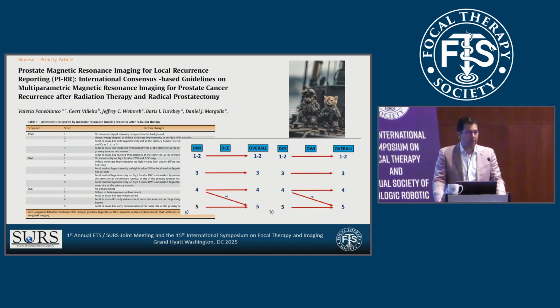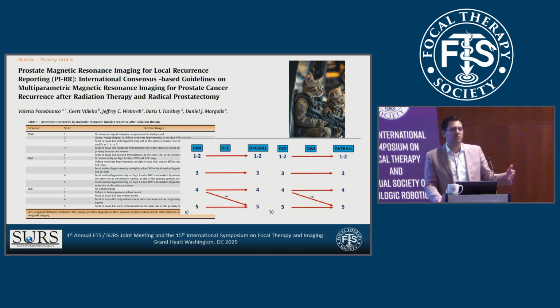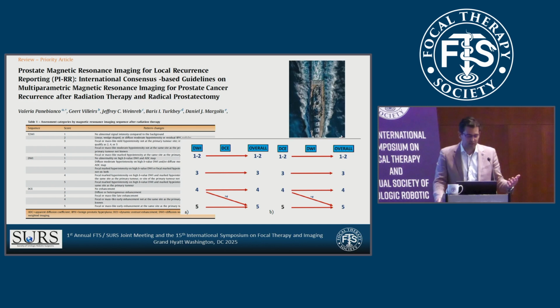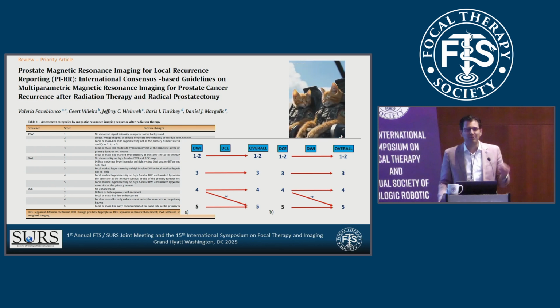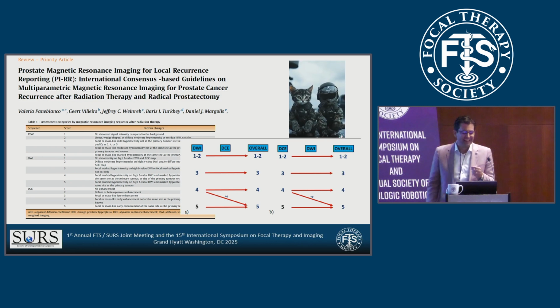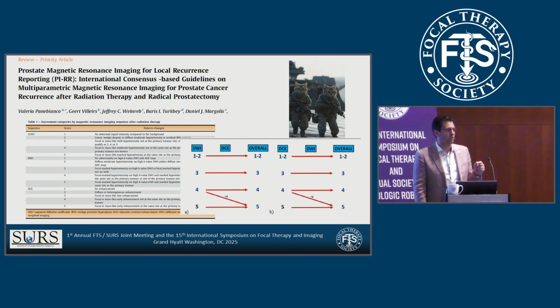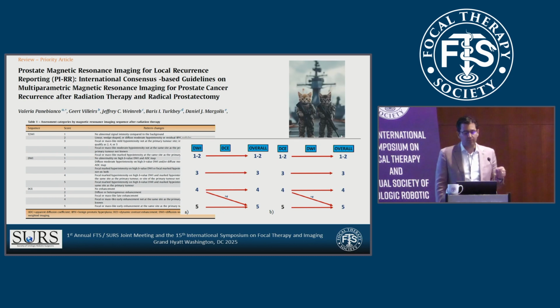This is my favorite one, PURR. A lot of cats are on the internet these days, so I couldn't resist. But this goes back to, God bless you, I'm trying to cite and discuss the challenges we have with grading an MRI post-radiation.